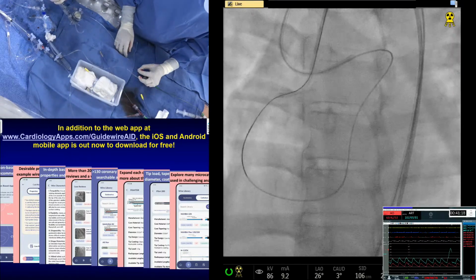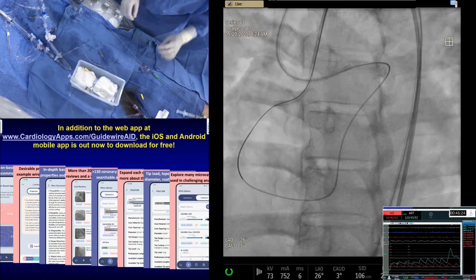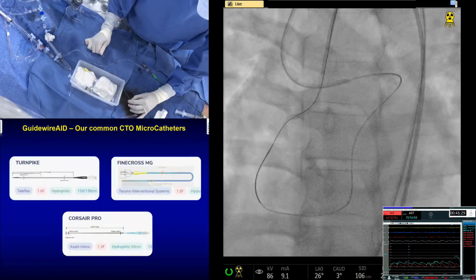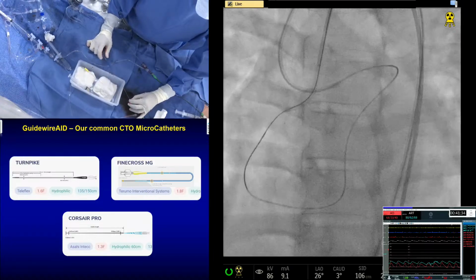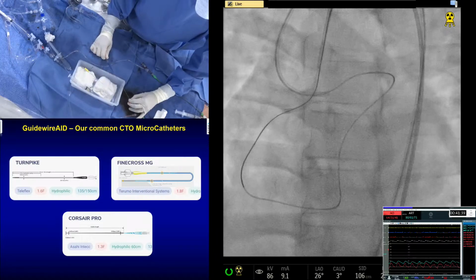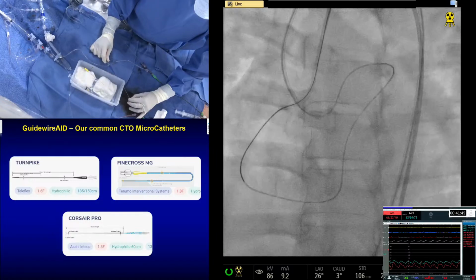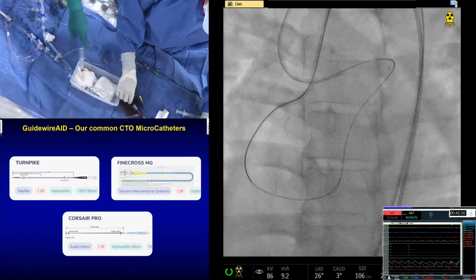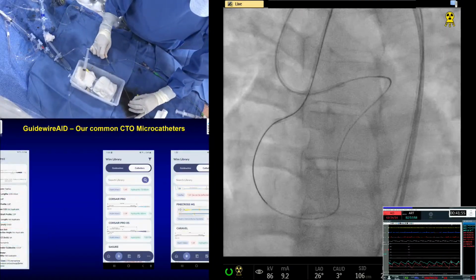So now we are anchoring the balloon. You see that in the guide the pressure will disappear. Yep, good. And now you can advance. You see that the guide is still going in left, but as long as you are careful, that is perfectly fine. It is just reaching there. Just an outstanding job. Good. Okay, now we can deflate.